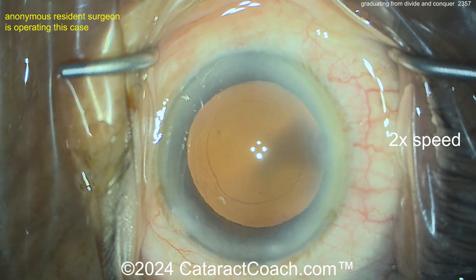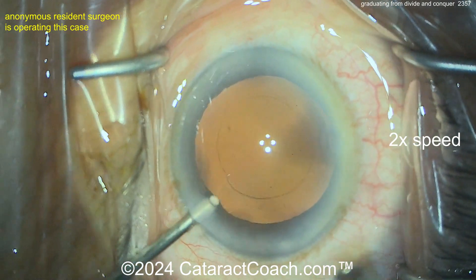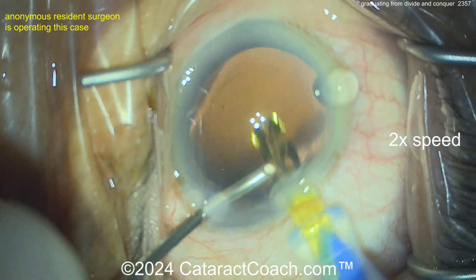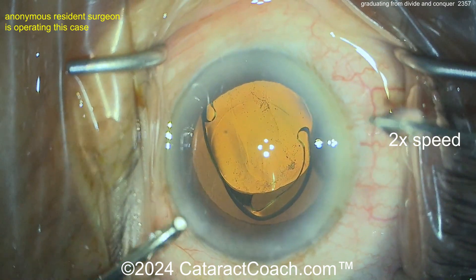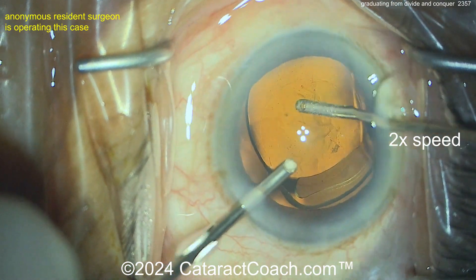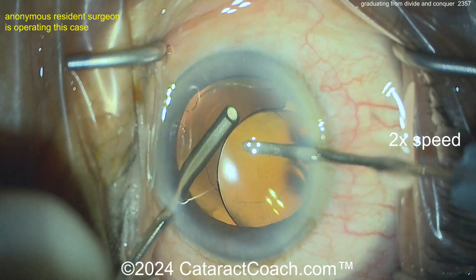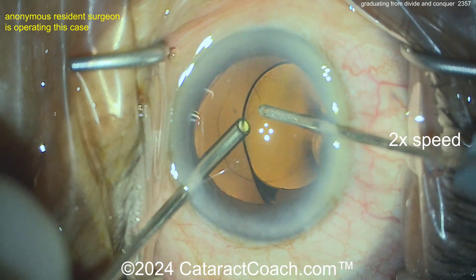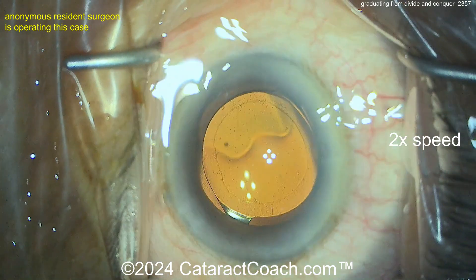Now let's see filling the bag with viscoelastic — here comes the lens. Wow, I'm impressed — great job for case 300, fantastic! There it is — single-piece acrylic lens, get it into the bag nice and easy, get it positioned. Manual I/A to clean up the viscoelastic — fantastic, going behind the lens even to do a little washing.